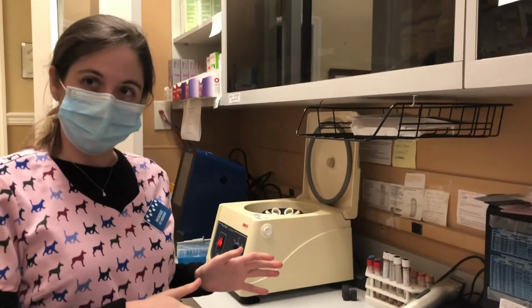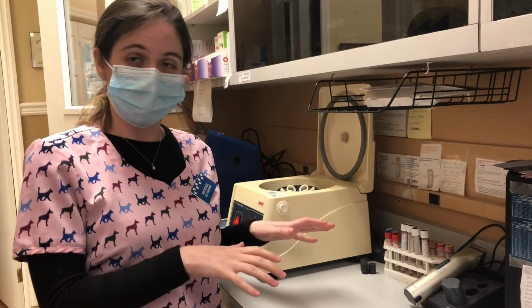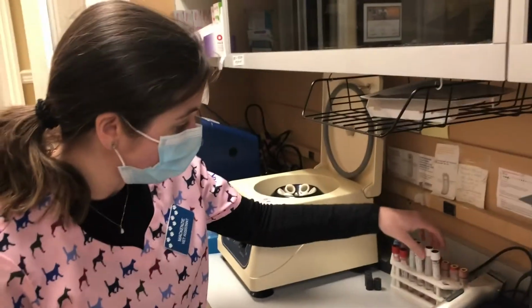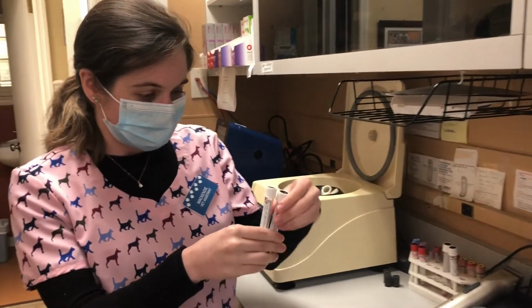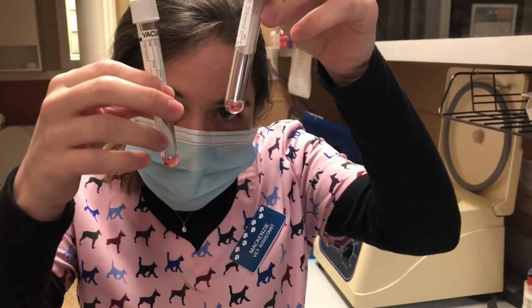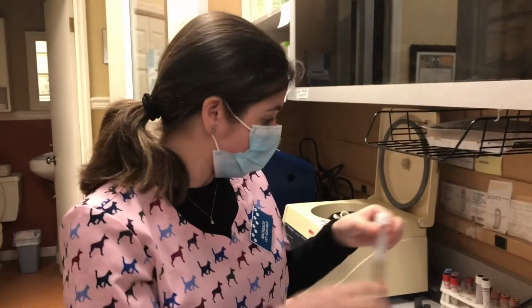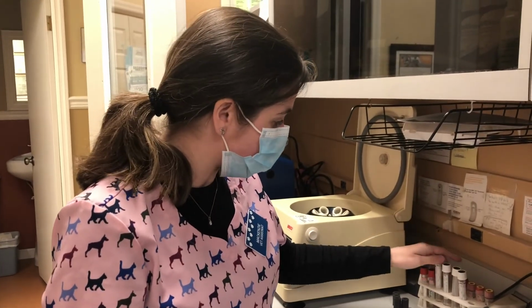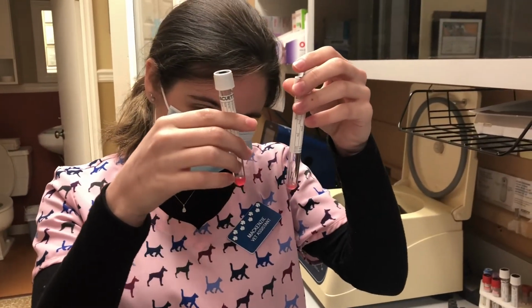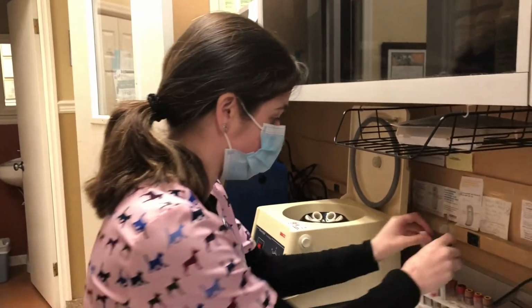So our major and our minor and our controls have all sat out for 30 minutes, and they've all been centrifuged. So we're going to take a quick look to see if we can see any agglutination present. So here are our major and our minor. You can see a little bit of what I would consider agglutination, but we'll double check under the microscope. And our controls, as you can see, not much going on there in way of agglutination, so that's good. That means our controls worked.